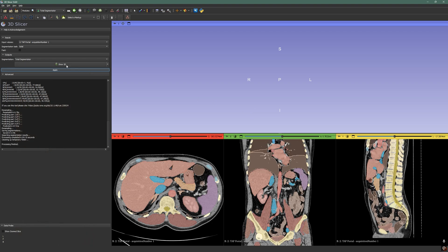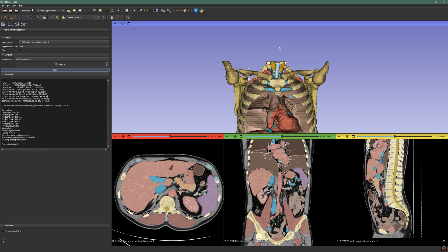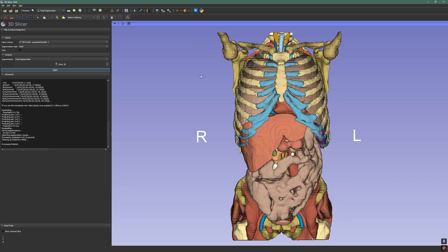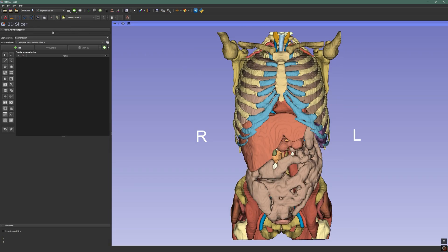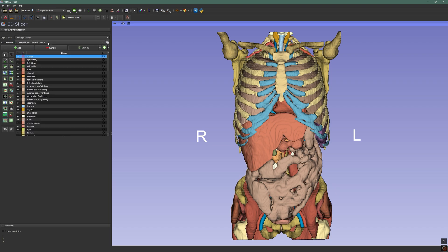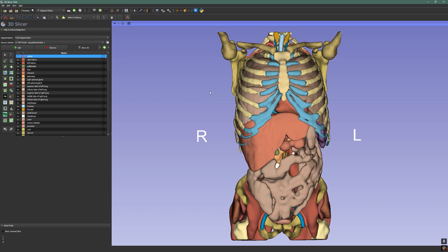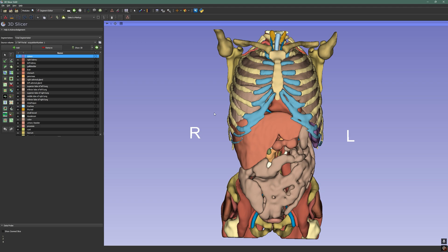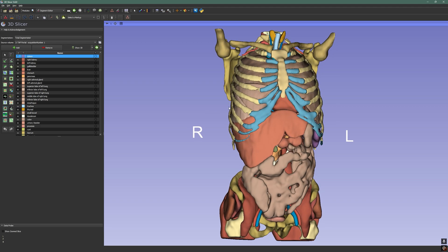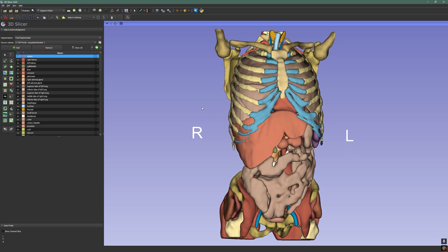Once it's finished, you can click on Show 3D. Click here to center the view, go into Segment Editor, choose TotalSegmentator, and you can improve the visibility by increasing the smoothing factor. And just like that, in a few minutes we get a complete segmentation of a lot of anatomical structures — everything is labeled and ready to use.